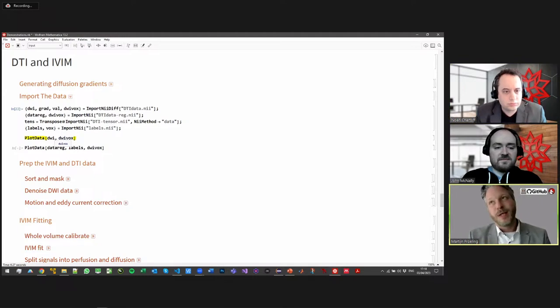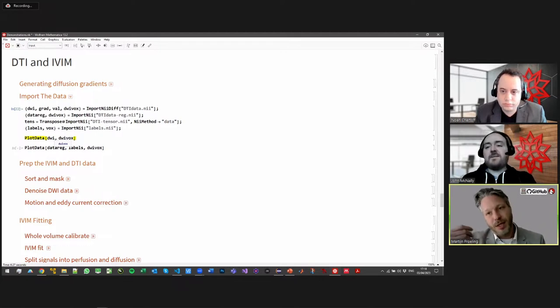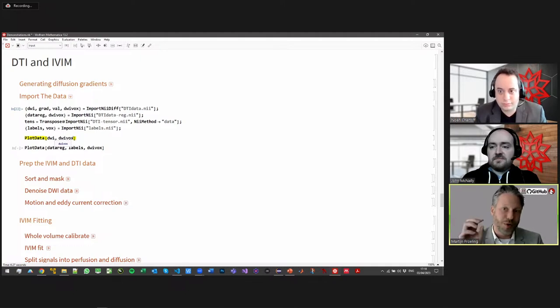So this is diffusion weighted data, where the sensitivity of the machine is set to diffusion. Basically, when we have motion of water molecules, this causes signal attenuation. So we lose signal due to the motion of water. And the amount of signal we lose is proportional to the actual underlying diffusion constant. The diffusion constant basically means the amount of random walk particles will do. So that's really on the molecular scale.